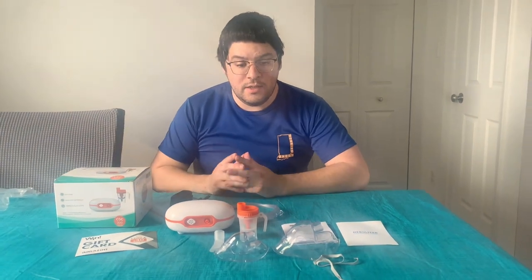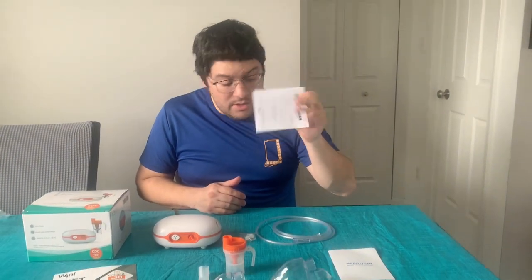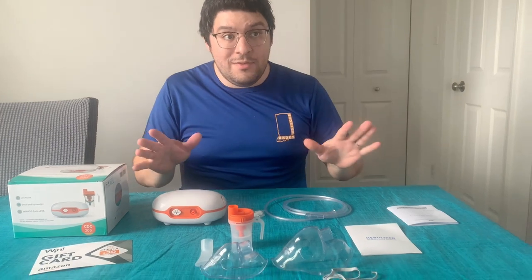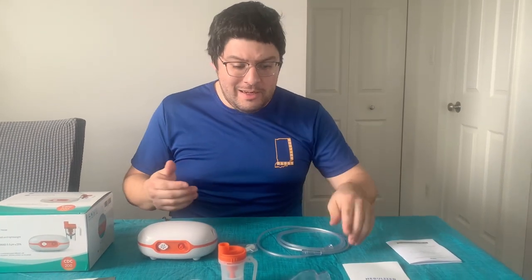So now that we have everything out of the packaging, let's go over setting up one of these ways to use it. Now that I've read the included instruction manual, I'm going to show you a brief overview of how easy it is. This way if you actually purchase the product, you can refer to this and won't have to read the book.